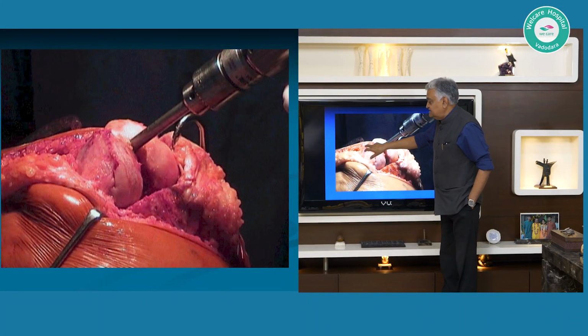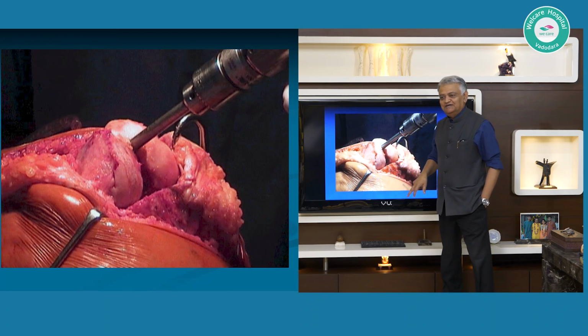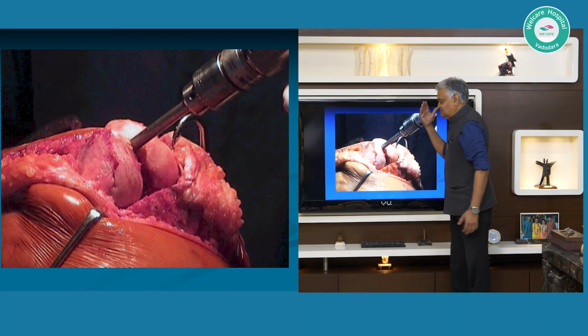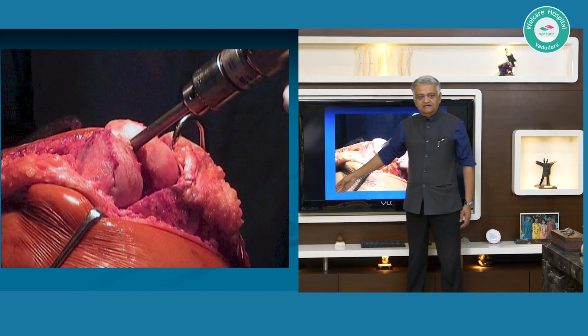Even when you put that minor 3.2 drill bit in, and if you are a keen observer, if your brain is alerted to whatever is happening around you, then you will see some blood being pushed out from the anterior cortex of the femur. Even with a 3.2 drill bit in a massive medullary canal like this, which is a voluminous thing, just imagine what is the pressure that would be generated when a rod enters the isthmus area.